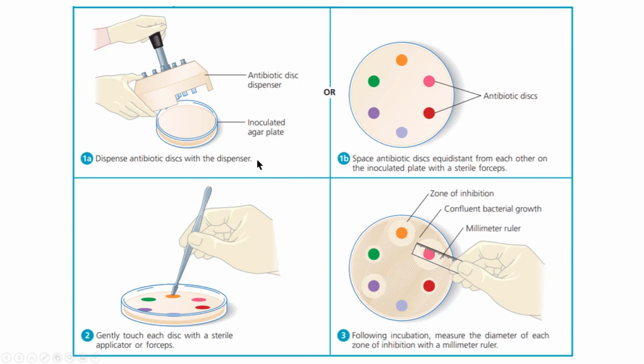And the way this works is that essentially, instead of test tubes, which you can imagine will be very labor intensive, broth microdilution takes a lot of space and requires a lot of labor, so it may not be feasible. And that's why we say it's a reference method. So a much more feasible method would be disk diffusion, and here's how it works.